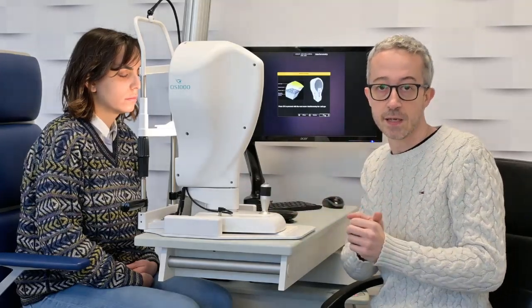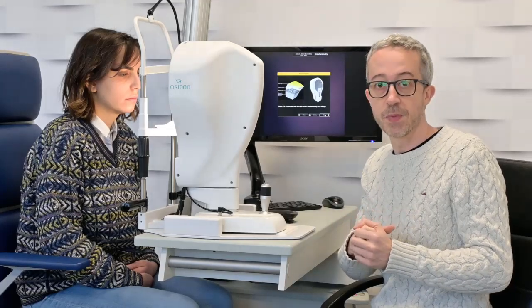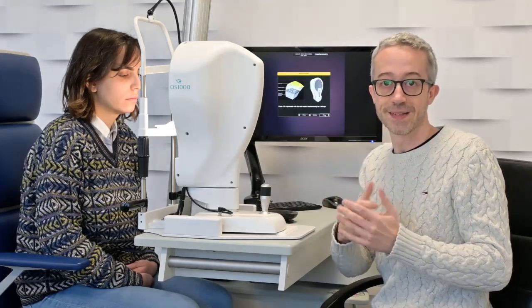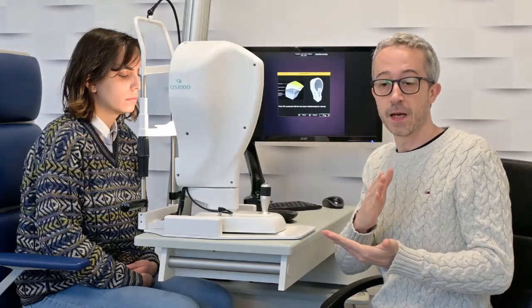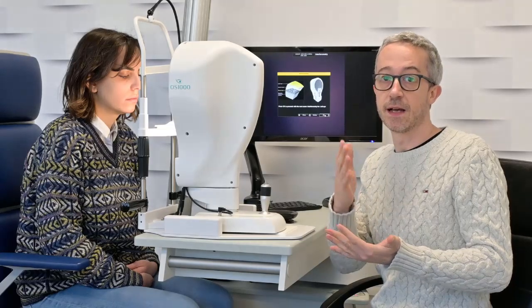To get more precision, you can add more blinks, but this will also increase the acquisition time. This is your decision. The 3 blinks measurement is suggested to have a video that is short but precise.